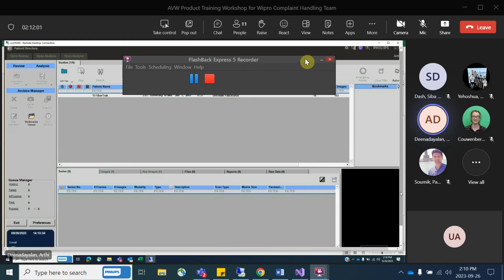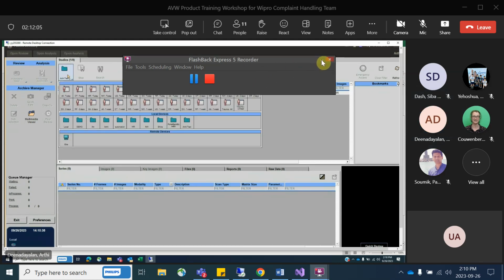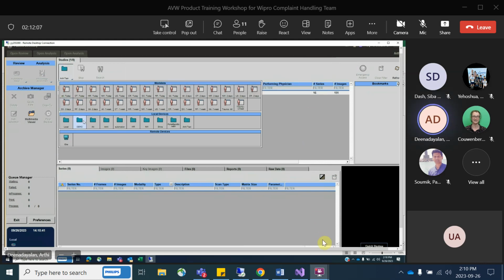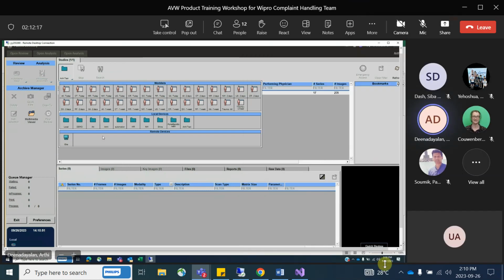Import the data. Anything that you want to know here? Anybody? Okay, I'll take it as a no. So now I'll just have, yes, Yuri.